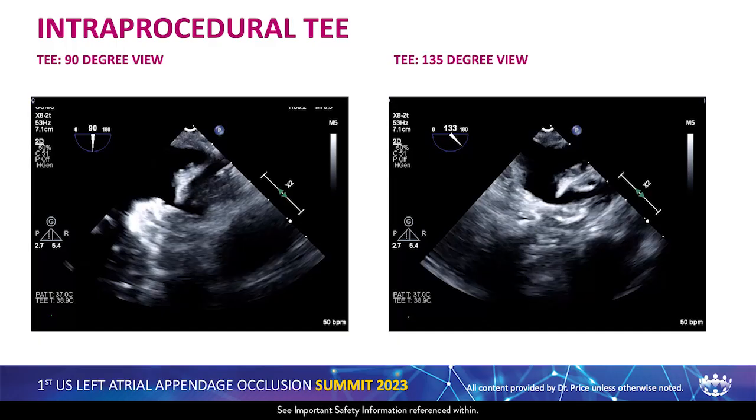So this is actually the intraprocedural TE. This is a TE guided procedure. You see the 90 and the 135. Like really hard to make heads or tails of what's going on.